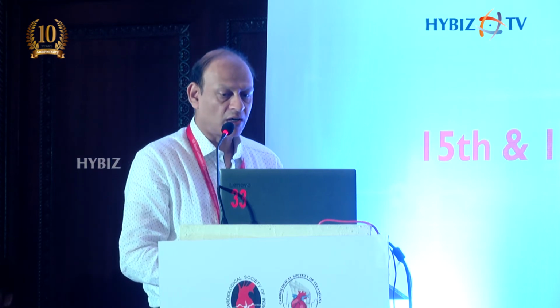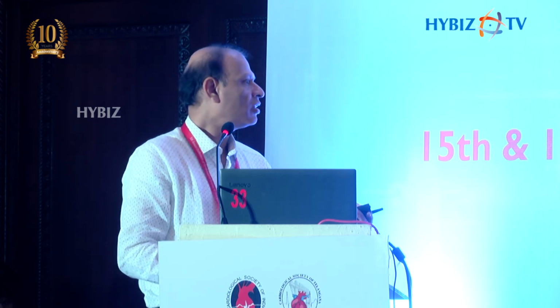Nevertheless, the most important point is we have the CT FFR also coming in now as a diagnostic modality to pick up patients with coronary artery disease who have obstructive CAD, which is hemodynamically significant. On your left, you'll see the percentage diameter stenosis and the various ways you are measuring your inducible ischemia with non-invasive methods like myocardial perfusion imaging. You have the stress test, you have the dobutamine stress echo, and on your right, on the lower side, you have the hyperemia indices and the resting flow indices.